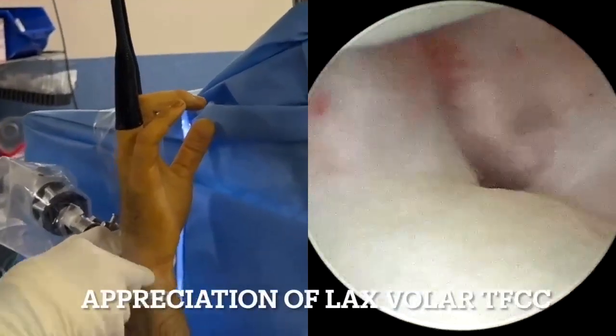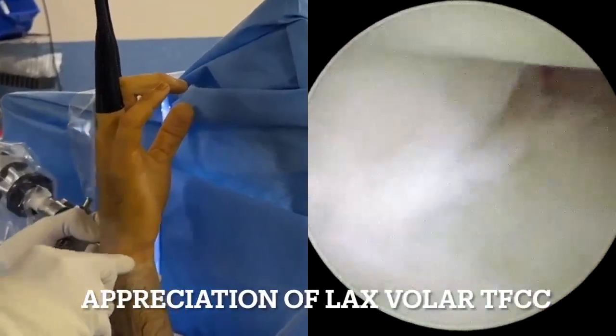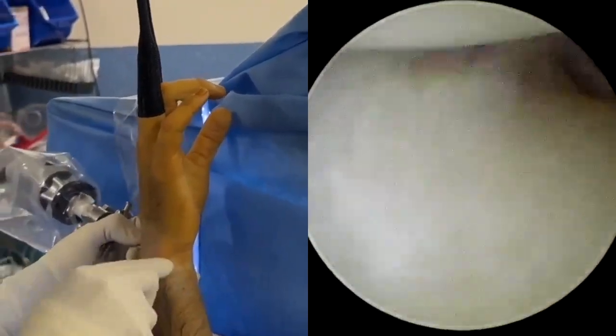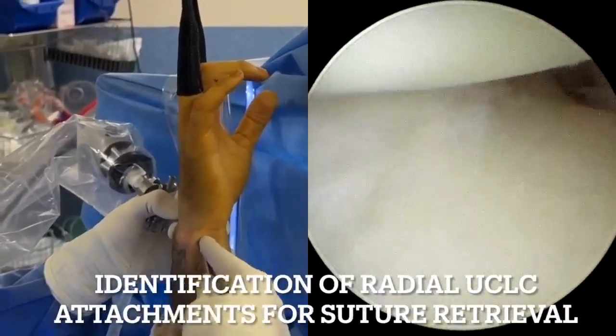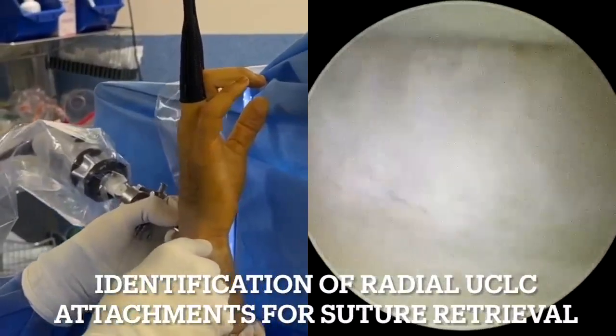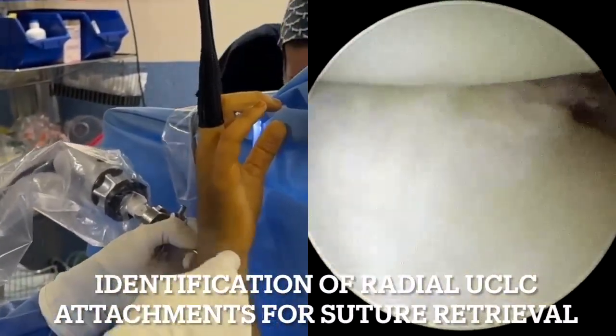One can appreciate the lax ulnar carpal ligament complex and palmar TFCC in this video. At this point, we attempt to identify the ideal area of the first suture retrieval near the volar sigmoid notch region.